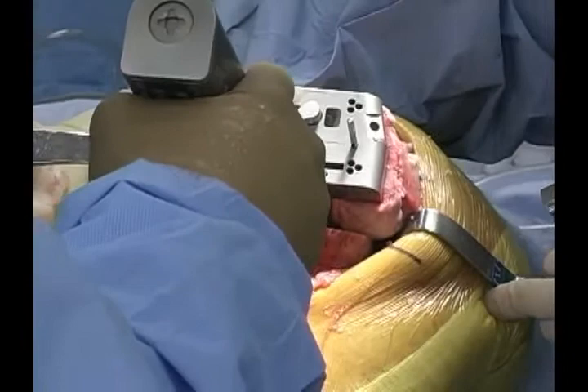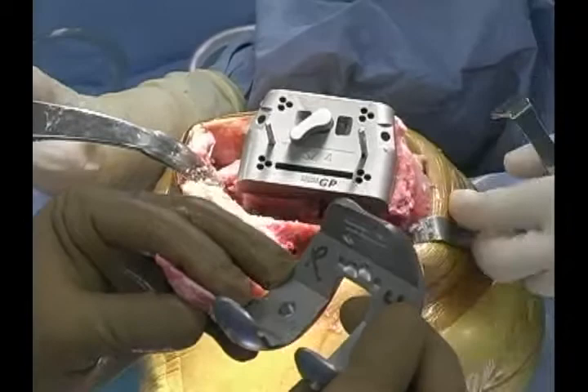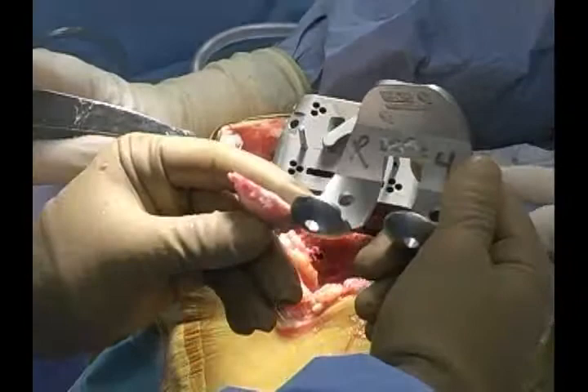For those of you that use the measured resection technique — if you're concerned about the thickness of the cut compared to the component, we're fairly close in this case. We don't rely on measured resection to estimate flexion space, but in this specific case and in various knees, it's going to be quite close to the measured technique.